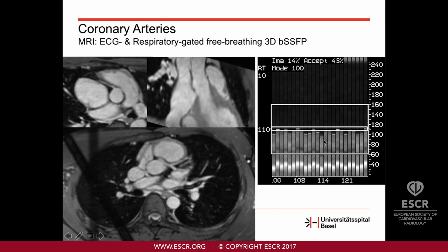So this is also a very strong predictor of a low likelihood of a coronary event in the future. So CT is a strong tool. The combination of calcium score and coronary angiography together is a very strong tool to guide therapy in suspected coronary artery disease.